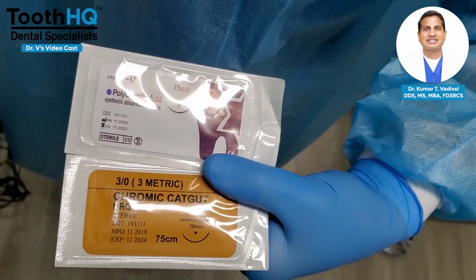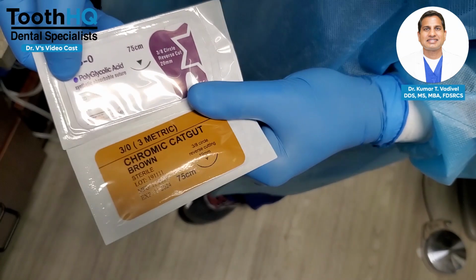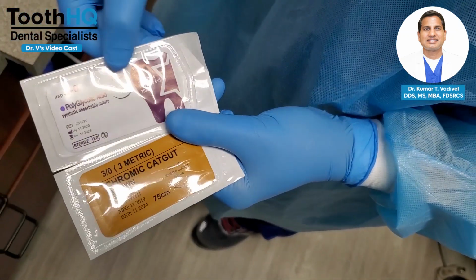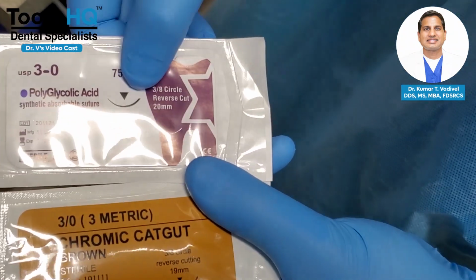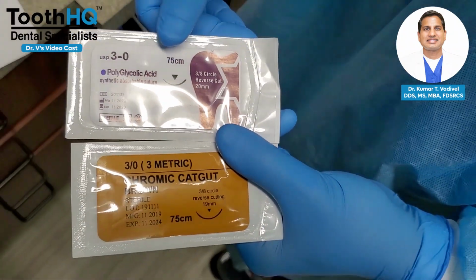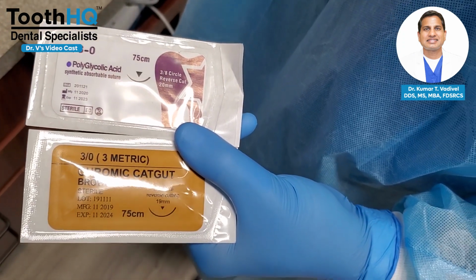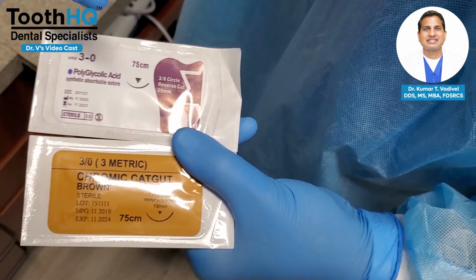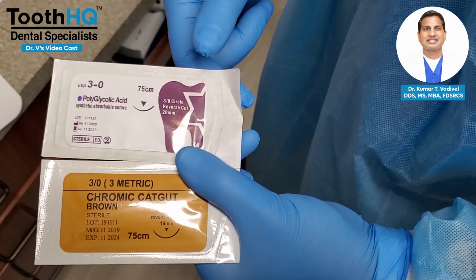So you guys have the option either to use a Vicryl, which is the synthetic, and I do not see the name here. It's a polyglycolic acid. This is the brand you can buy, and I'll show you the box if you guys need it, or I'll put it on the slideshow. And this is a chromic. Either you can buy a chromic or a Vicryl, but I'm going to use the chromic here.